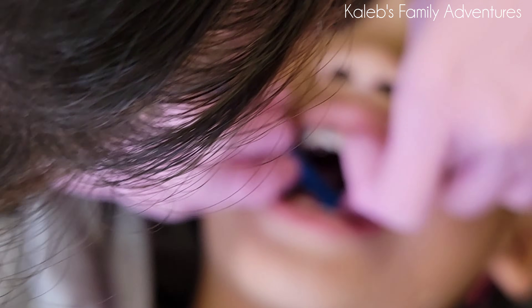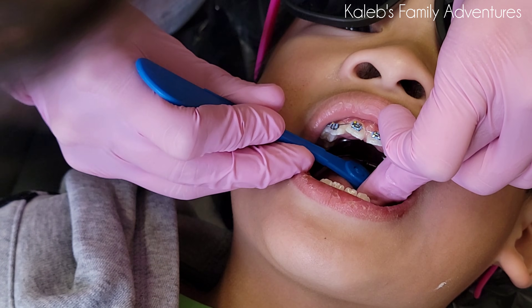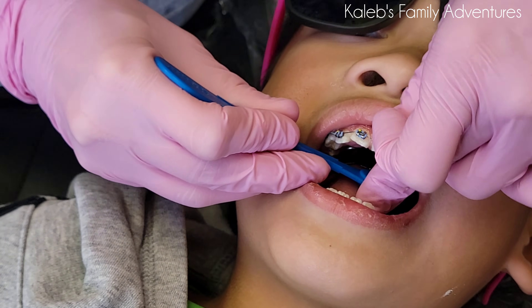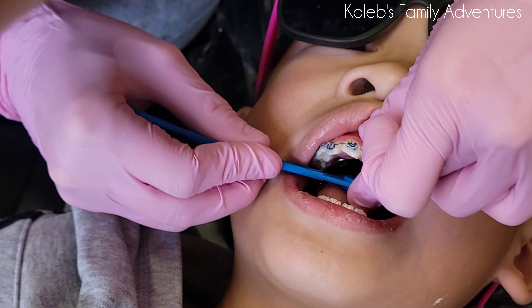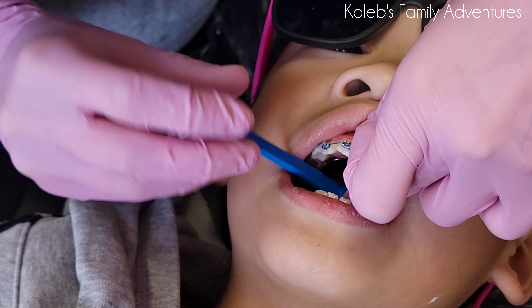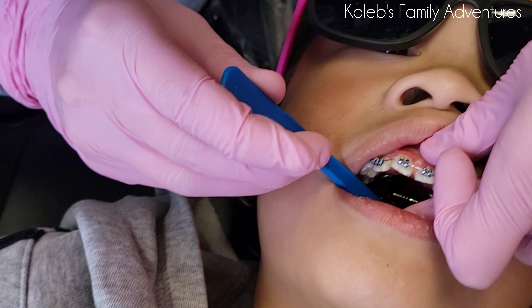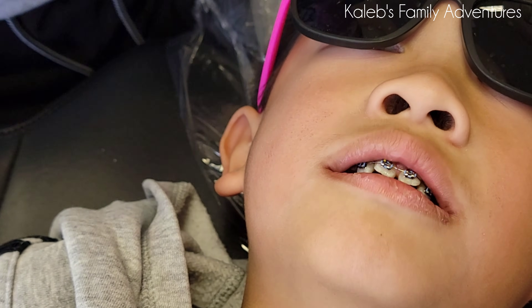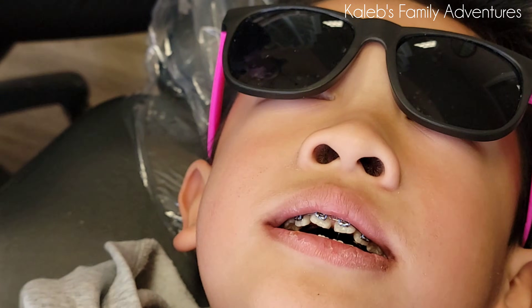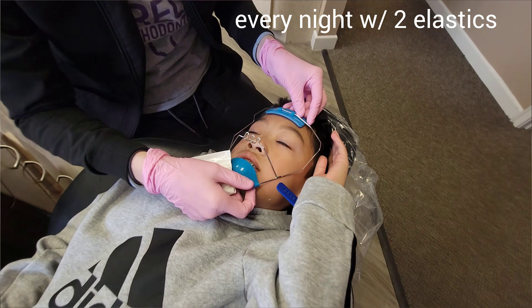Why do you need to do that? This is going to turn his RPE — this has to be done three times a week, so like Monday, Wednesday, Friday. Yes ma'am. Push it down like this and it's gonna slowly, as it's turning, expose another hole — that's one full turn.